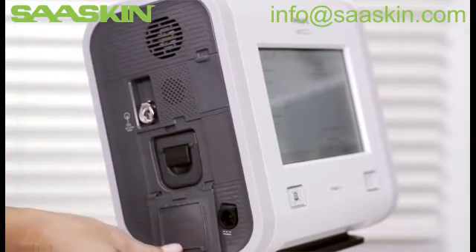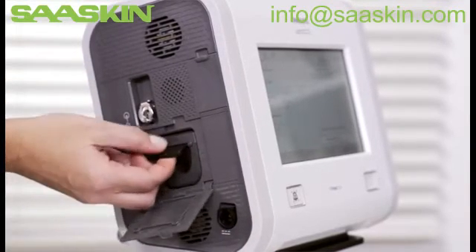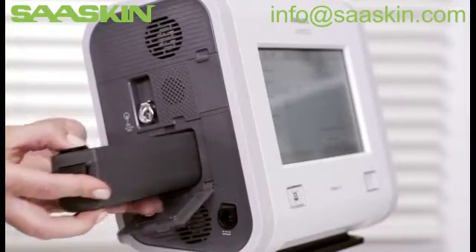To remove the detachable battery, open the access door, then lift the battery handle and gently pull it out of the battery bay.